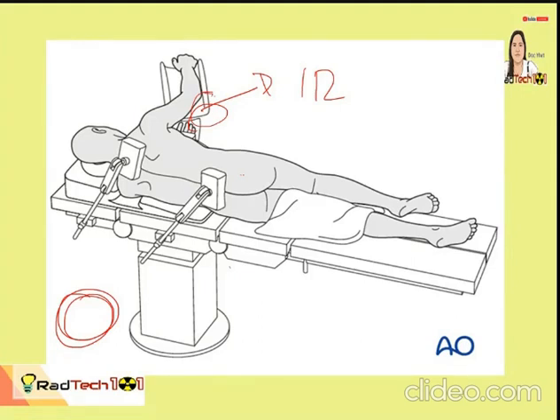Right lateral decubitus? Or left? It's postero-anterior decubitus. Left lateral, Doc. So to review, when we say postero-anterior or antero-posterior, this is projection.